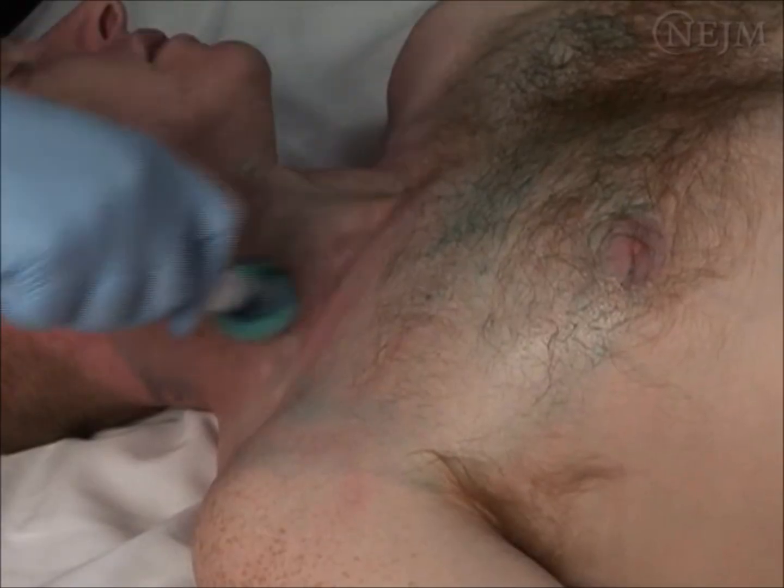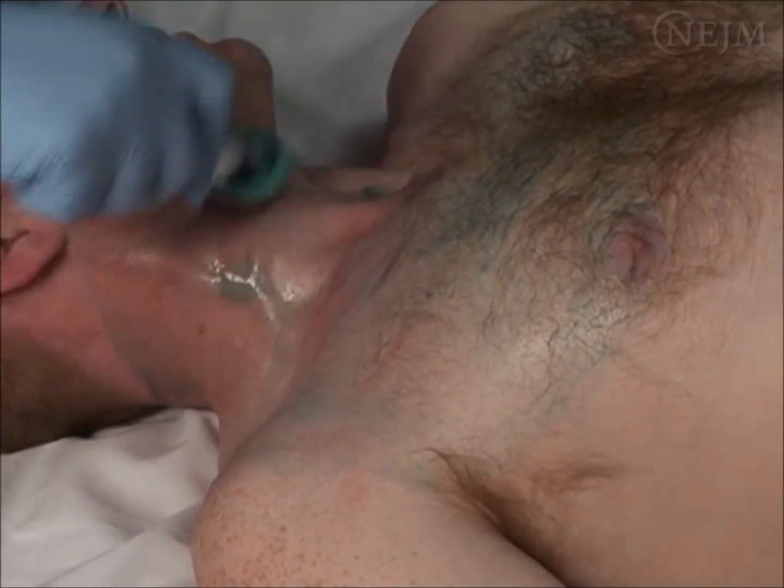Prepare the area by scrubbing the skin with chlorhexidine for 60 seconds and drape the site.